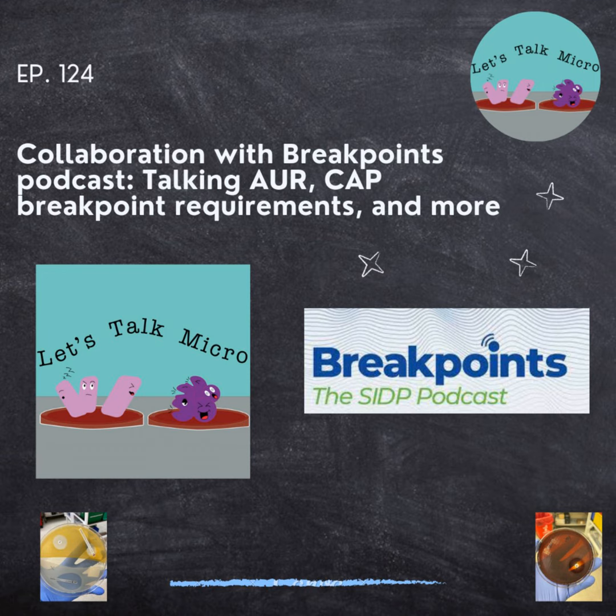And I don't know, it brings that nerdiness out. Every time we see something that maybe we don't see as much as microbiologists, it gets us excited to hear something new. We can learn more. We can continue to build that knowledge in our head that helps us become more proficient on our job. But it makes us think. When we put organisms on media, we definitely know that MacConkey is for gram-negative rods. And sometimes an unfortunate thing that happens, especially with new technologists, is that you see it's not growing on MacConkey and then you assume it's not a gram-negative rod. There are many reasons for that. Unfortunately, the Gram stain, a valuable tool, is not being used as much. But it makes us think just how different the organism can be.